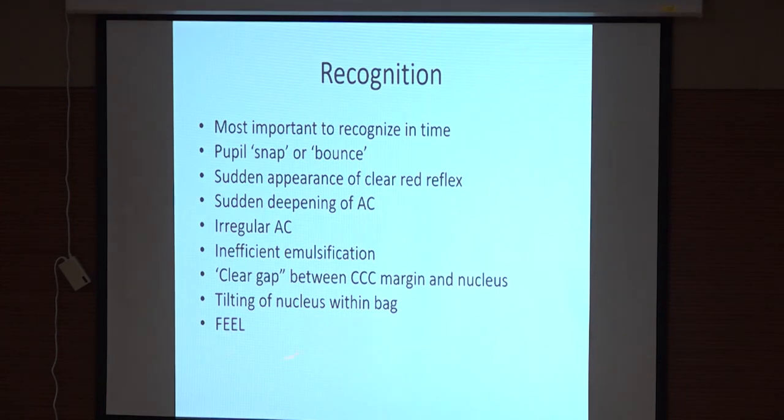And the final is the feel. As you do more surgery, you realize this is not proceeding well. There is something wrong here. The moment you have that, you must stop, but not bring out your phacoprobe.